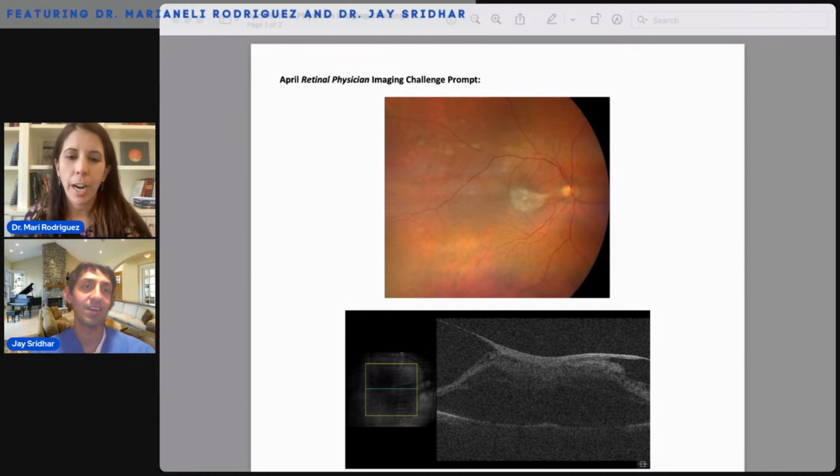I thought it was mostly tractional. And once I lifted that hyaloid, things kind of settled down so nicely. I didn't see any inflammatory reasons why she had this. And so I didn't do any intravitreal or subtenons steroid. I'm with you. I mean, she's phakic, and ideally you put off her cataract surgery as long as possible. No, she was pseudophakic. Okay. But she did really well.